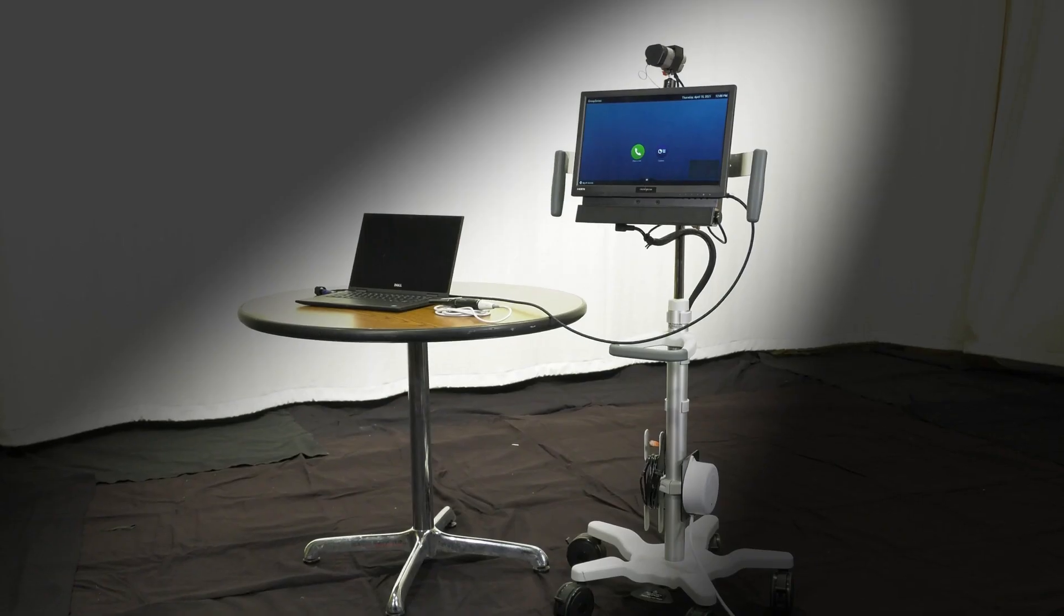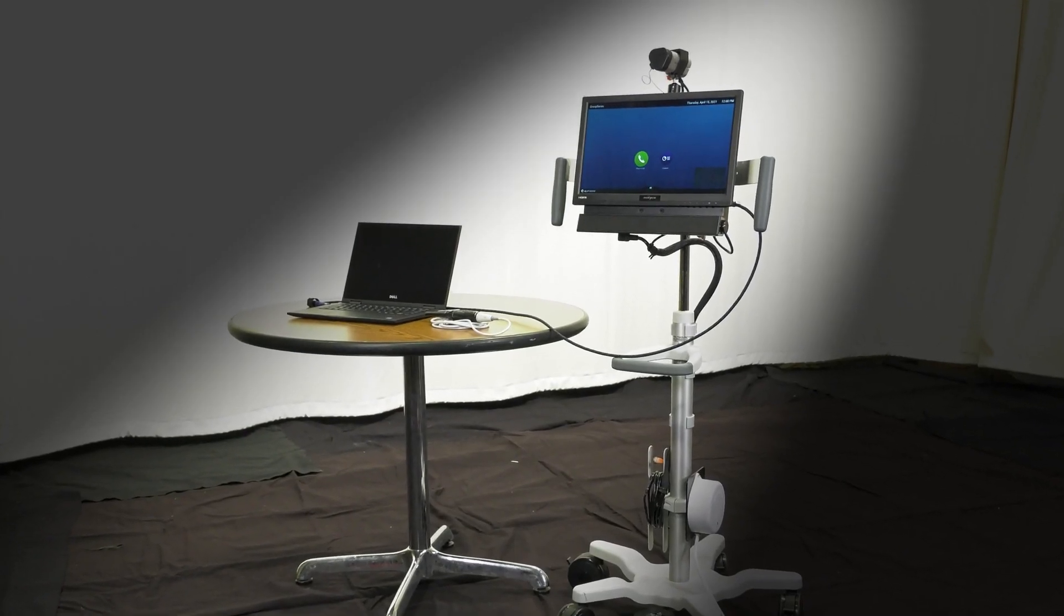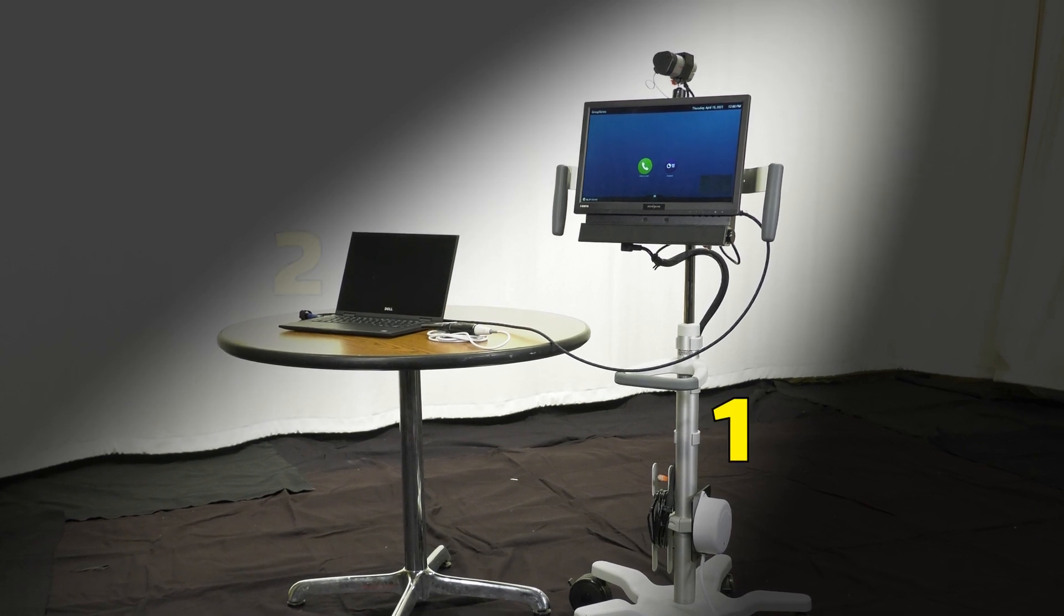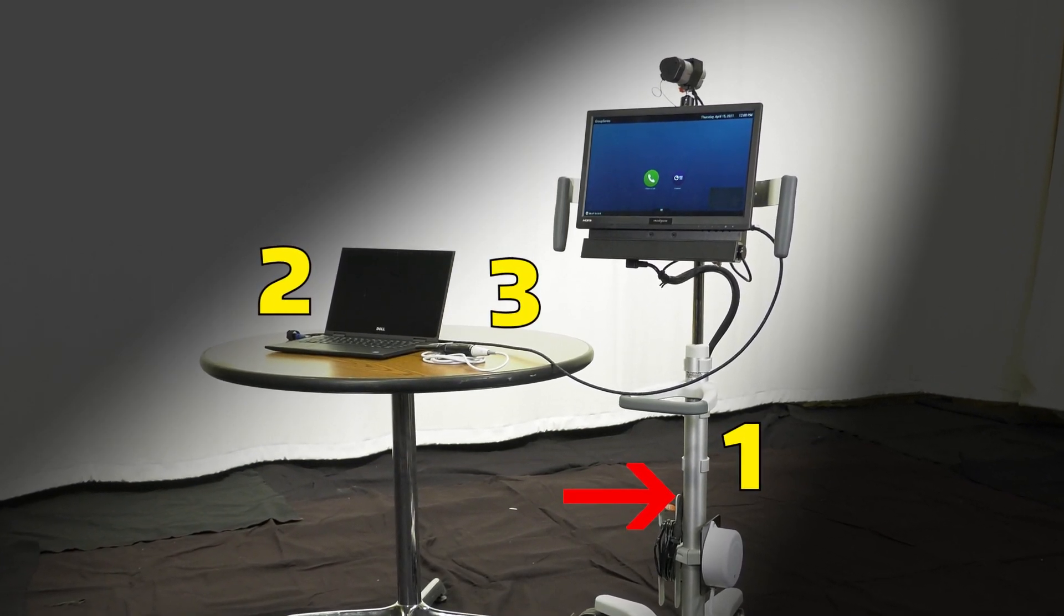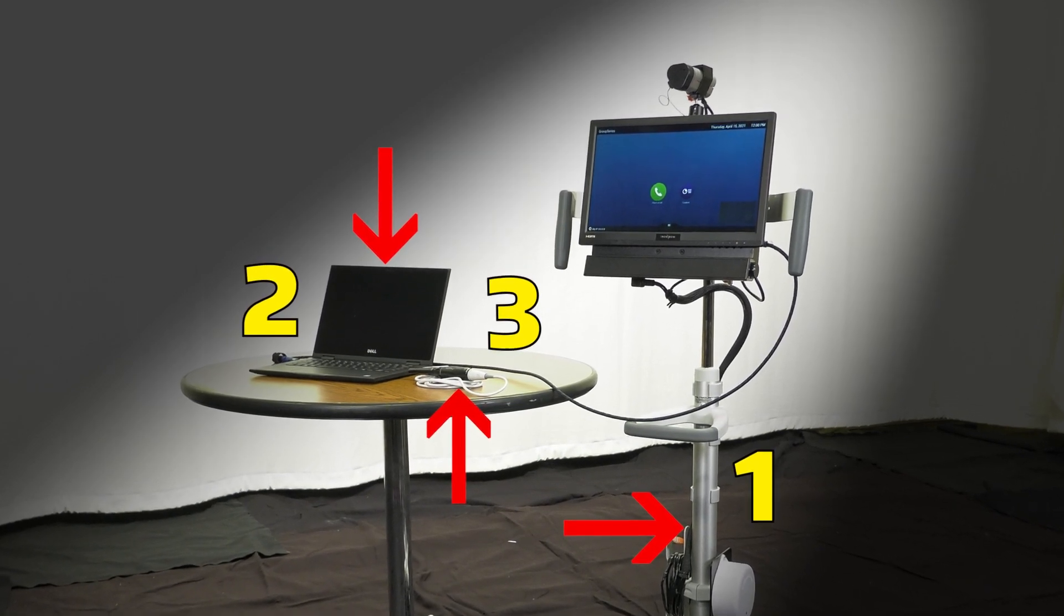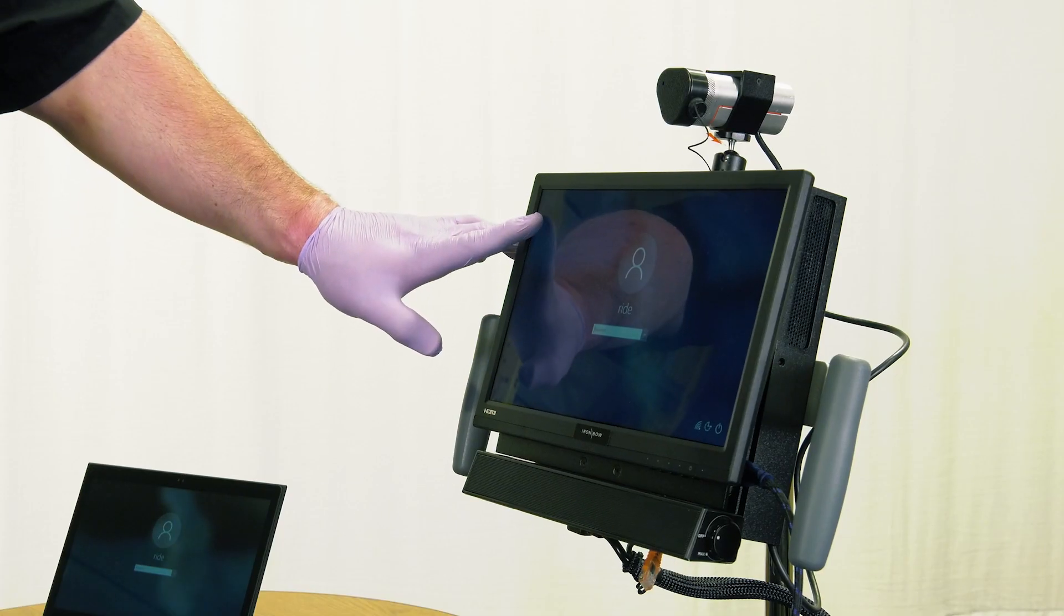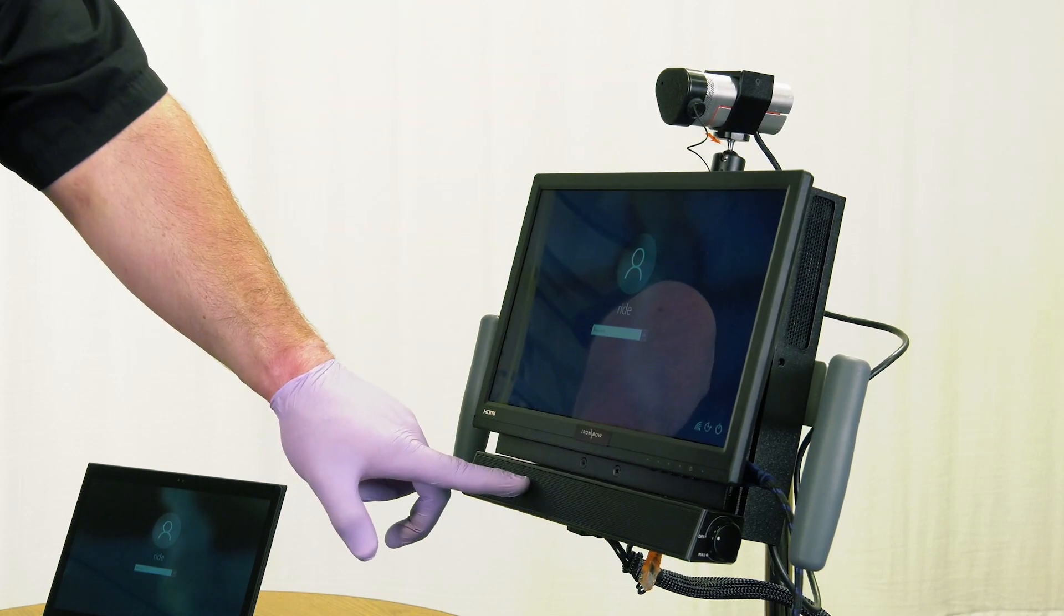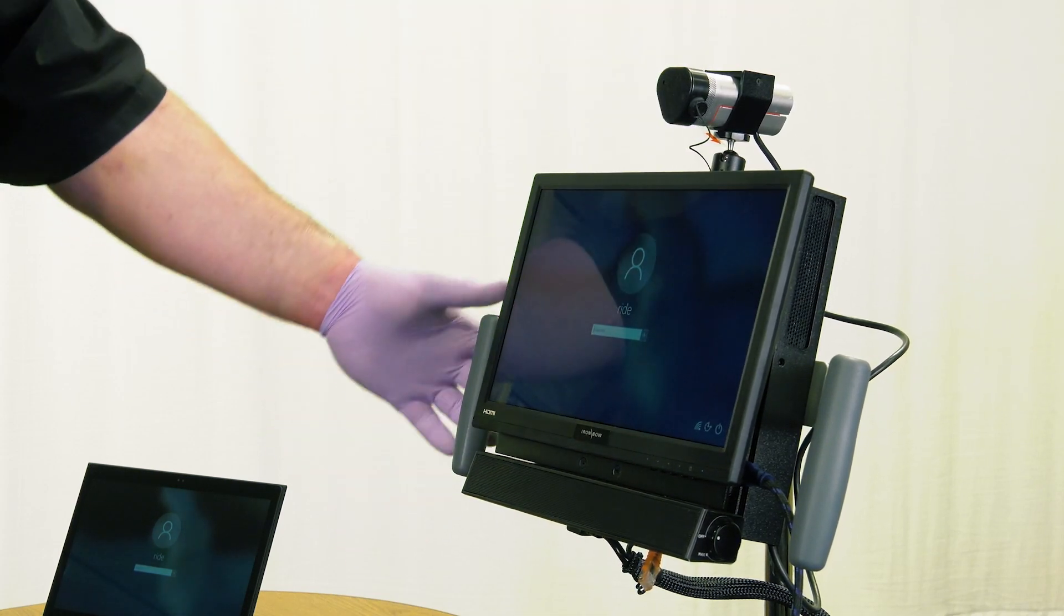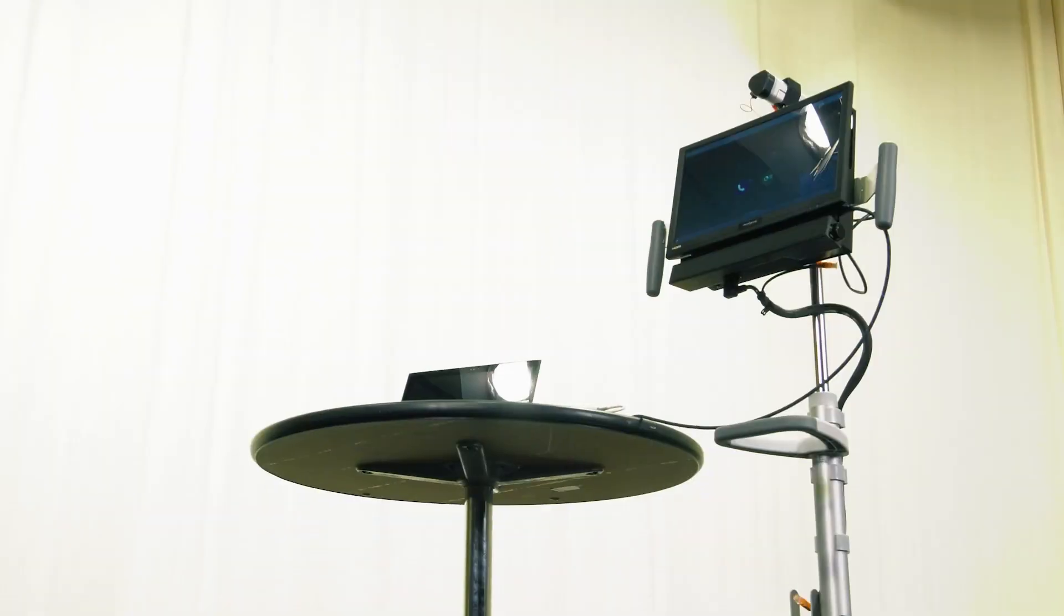The RIDE Teledentistry Video Conferencing Cart consists of three main components: the portable cart unit, the laptop, and the intraoral camera. The cart unit consists of a touchscreen, video codec, speaker, camera, adjustable frame, and base.